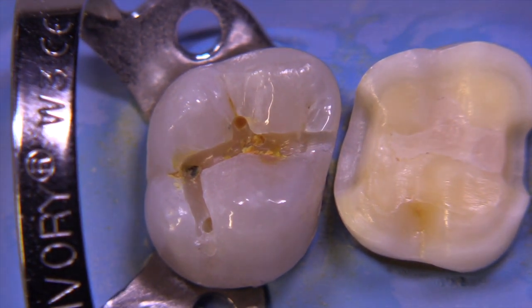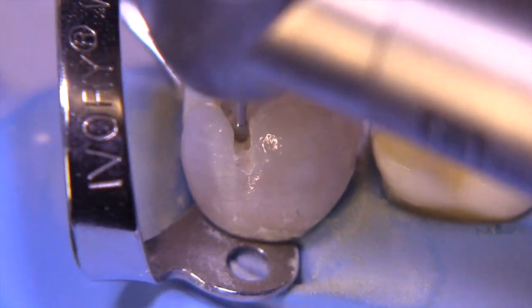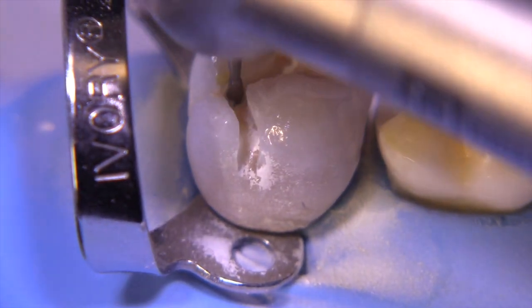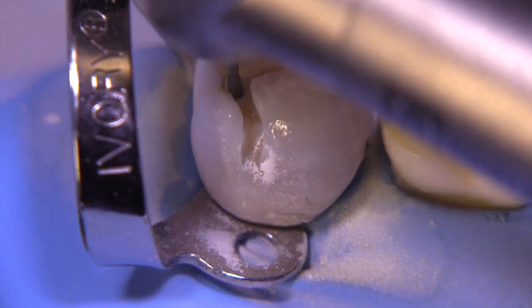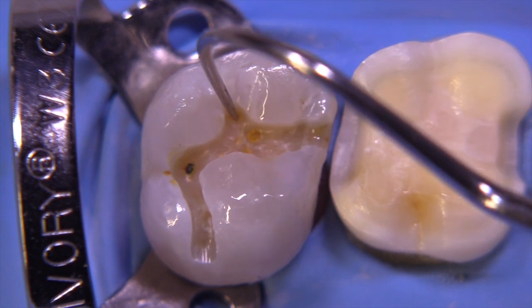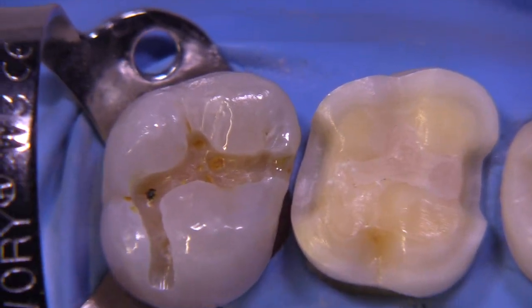Once you get the outline form wide enough, you can go ahead and convert into the caries removal process. I've sped up this next section to get us to the point where we have a preparation design that lays the framework for caries removal — we try to expand the outline past the caries. We have a lot of decay still remaining on the pulpal floor, a little bit on the lingual, and a significant amount on the mesial, underneath that mesial lingual cusp.